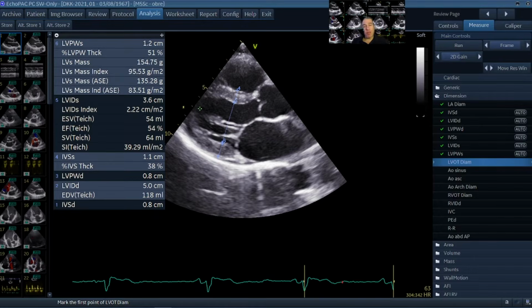But for some purposes, particularly if you study patients with hypertension who have no regional wall motion abnormalities and a symmetrically shaped ventricle, or for some larger population-based studies, this can be well used to get an estimate of left ventricular mass. But be careful, it's a one-dimensional measurement and you have no information about what is happening, for example, at the apex here.